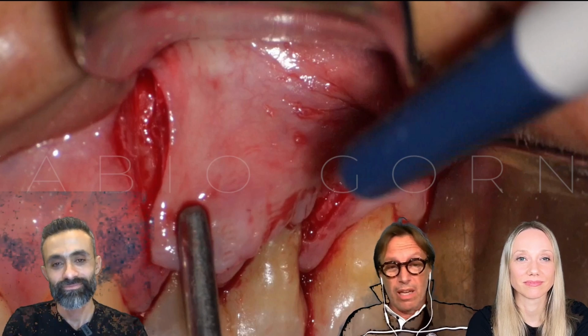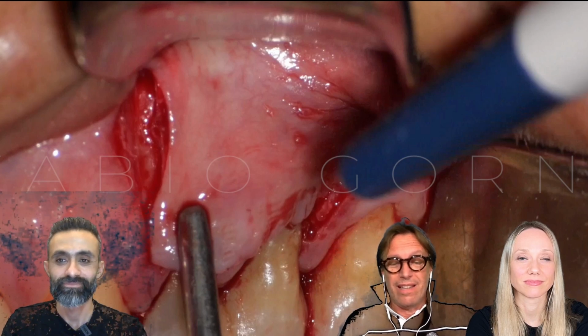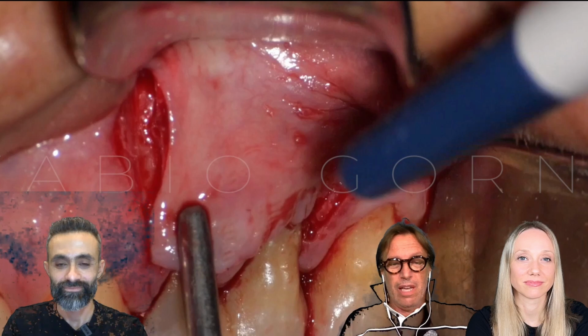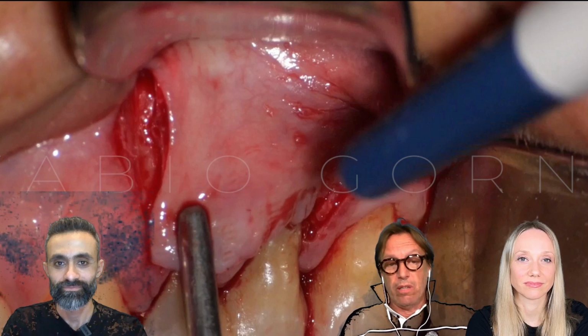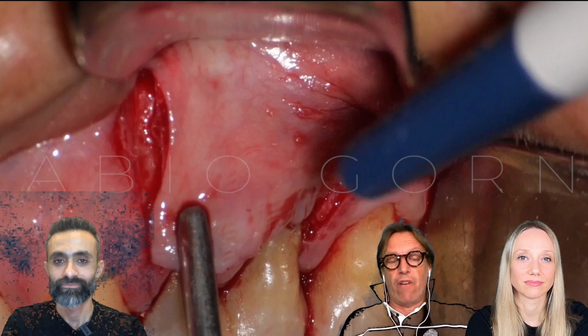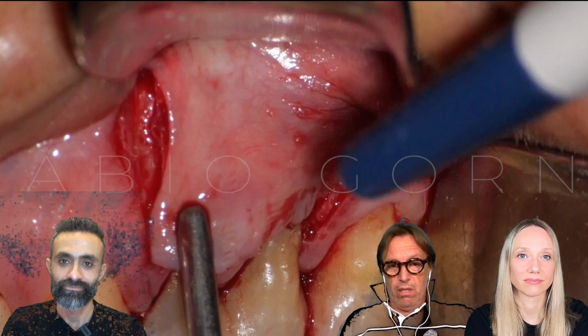I love MTA. I started to use MTA in 1998. It's a fantastic material. And in some cases, I'm still using MTA also in apical surgery, especially when we have a very, very large retrocavity.